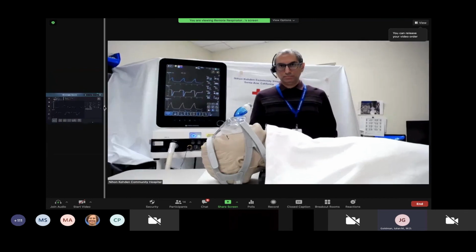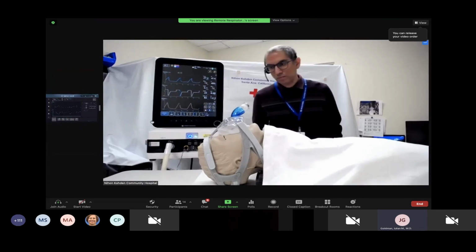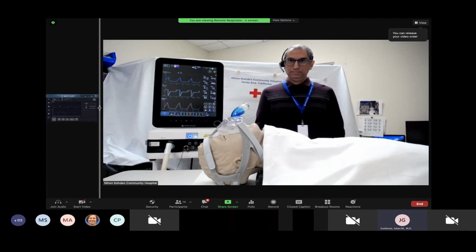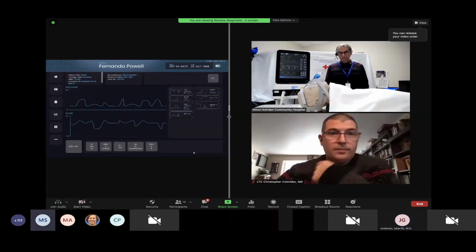Okay, well, it looks from here like the patient's doing okay. Miran, is everything all right at this point? He seems to be doing all right. I'll keep an eye on the O2 saturation. Okay, well, we'll still be here, and if you need more help, please don't hesitate to contact us, okay? Will do. Thank you so much.